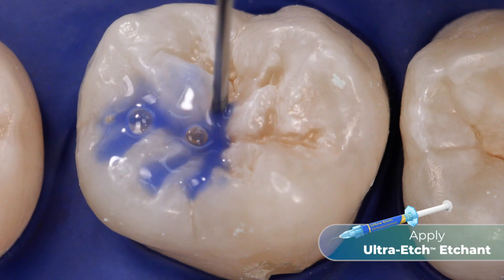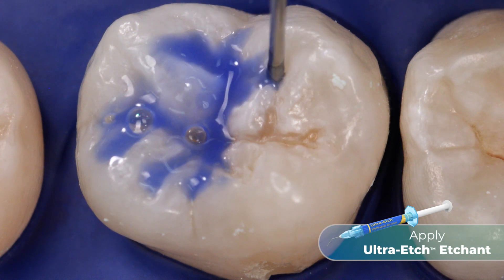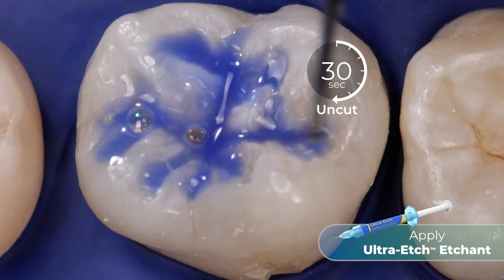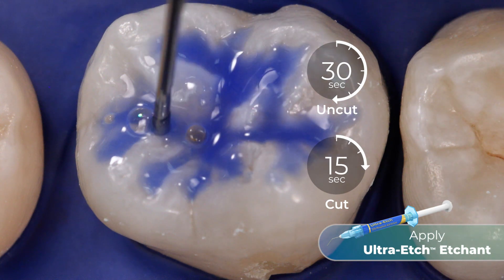Once the tooth surface is prepared, apply Ultra-etch Etchant, a 35% phosphoric acid etchant, to the fissures for 30 seconds on uncut enamel or for 15 seconds on cut enamel.